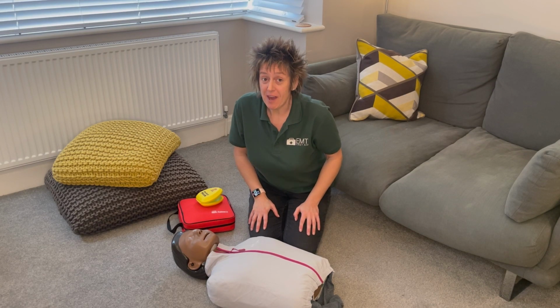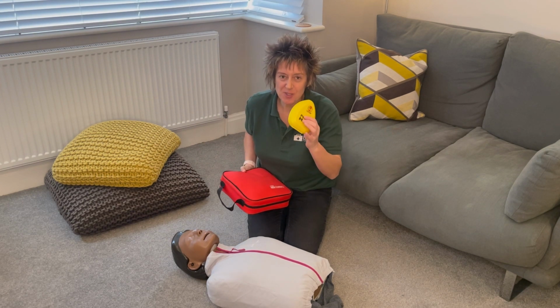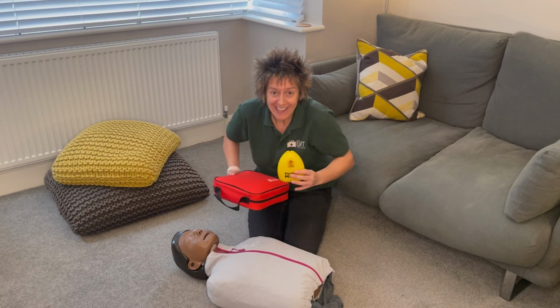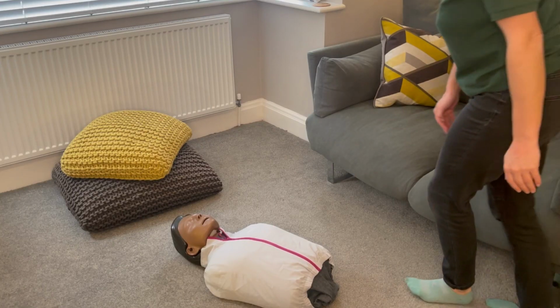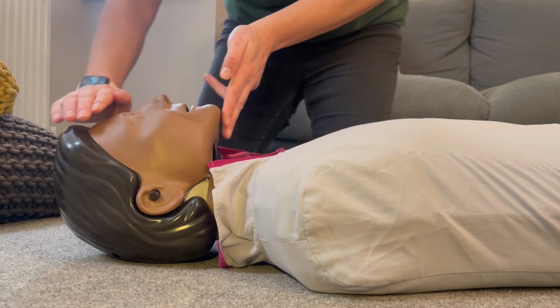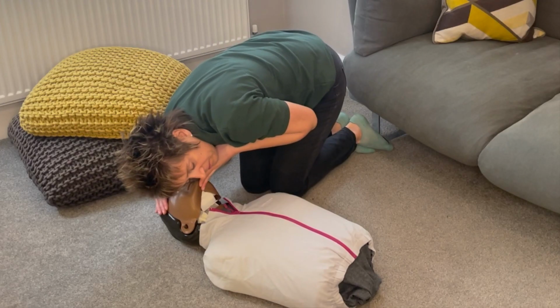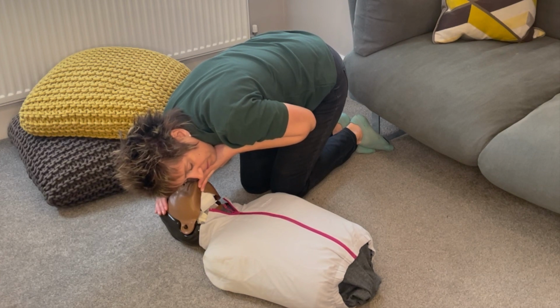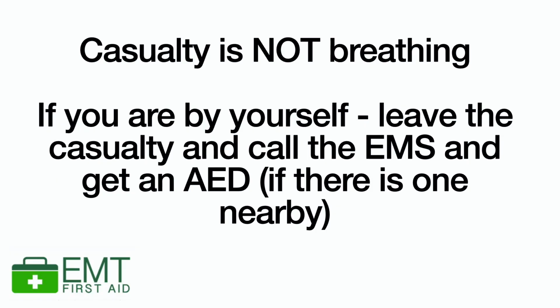And now to show you CPR version 3 using an AED and a pocket mask. And also, let's do without a pocket mask. Ready? D for danger. We're looking, we're listening, we're smelling for things that could be dangerous. We'll see if they respond, we'll give them a bit of pressure on their shoulders, and maybe make a loud noise to see if they respond. There is no response. So then I do A for airway. I open the airway with a chin lift and a head tilt. And then I look, listen and feel for breathing for up to 10 seconds. So I'm looking at their chest rising and falling, I'm listening with my ear, and I'm trying to feel for breath on my cheek. Now this casualty is not breathing.